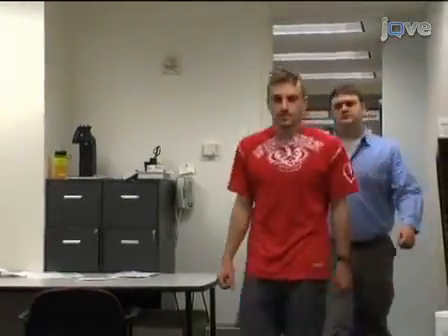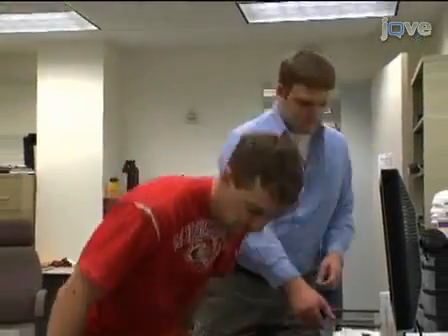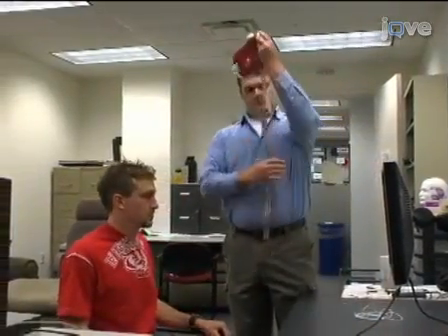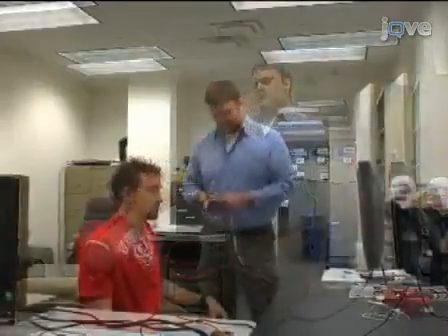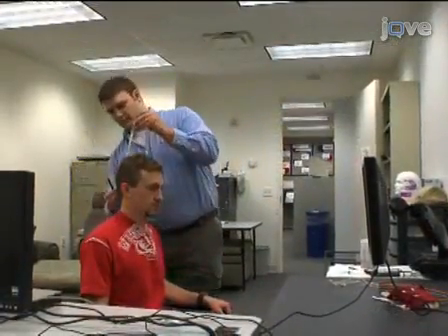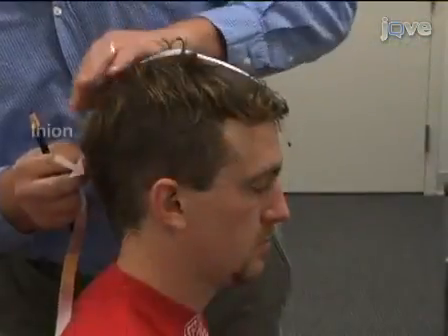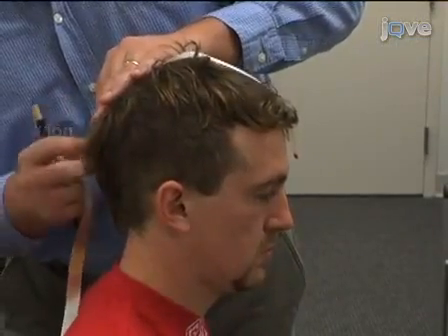You begin this protocol by connecting EEG electrodes to the subject's scalp through an EEG cap, which positions the electrodes according to the 10-20 International System. To correctly position the cap on the subject's scalp, use a felt-tip pen to mark the nasion, which is the intersection of the frontal nasal bones, and the inion, the largest protrusion of the occipital bone.